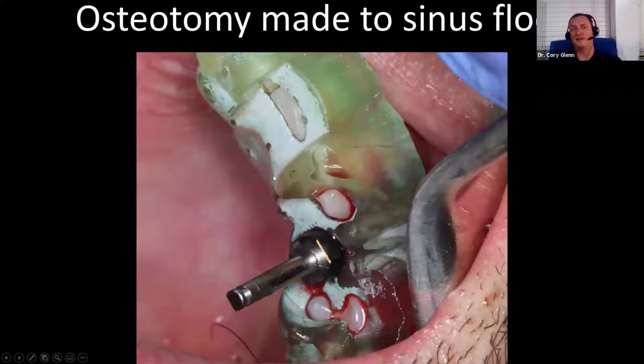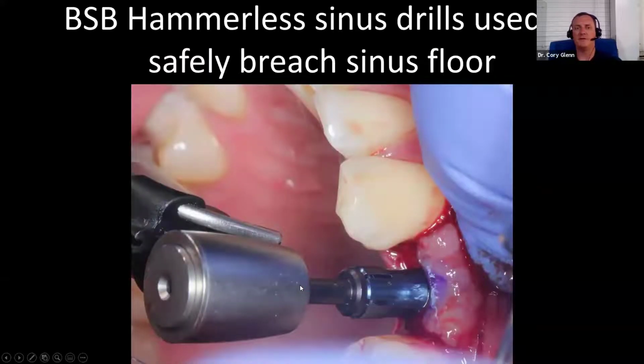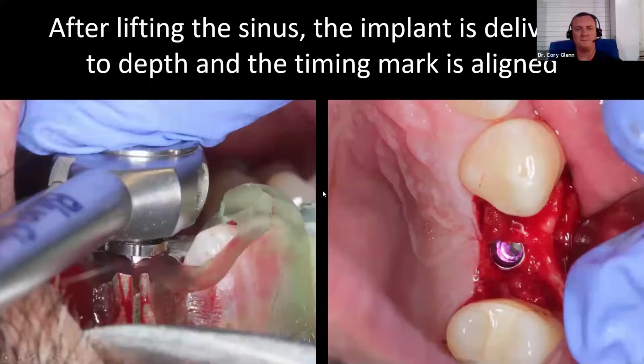And again, we had to do a sinus bump here. So we didn't go all the way to depth. We just went to the sinus floor. And then we switched over to the safe-ended sinus burrs. And these allowed us to breach the sinus floor and get access to the membrane without perforating it. It's a really dummy-proof kit. We have a guided version too, although I was using the non-guided this day.